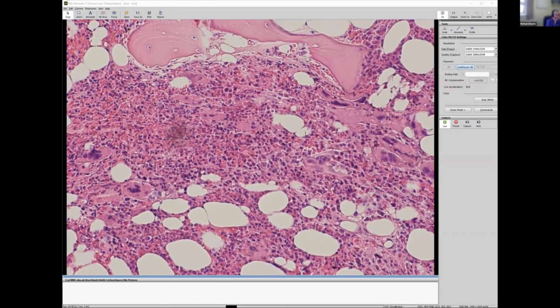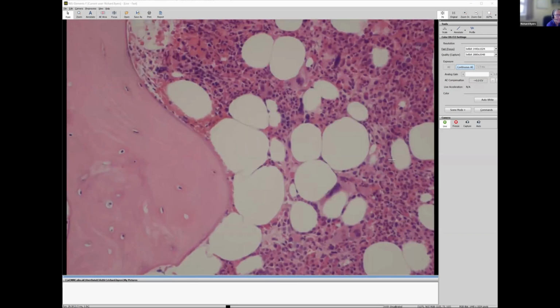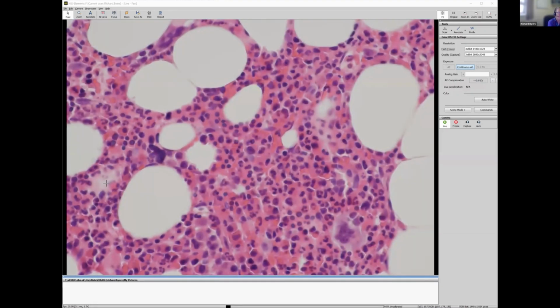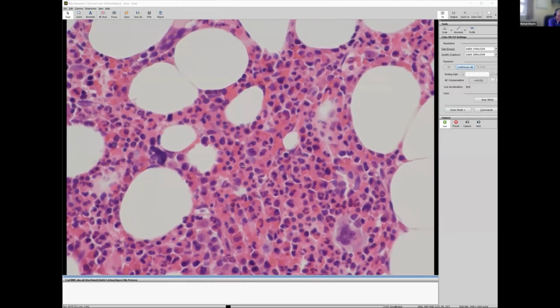There's also a minor degree of streaming artifacts due to increased fibrosis, the cells lying along lines. So you've got an area of megakaryocytes there, and some here. Also got little clusters of megakaryocytes here. They've got very abnormal nuclei, another cluster there. And it's associated with increased myelopoiesis and well represented but slightly disrupted erythropoiesis.